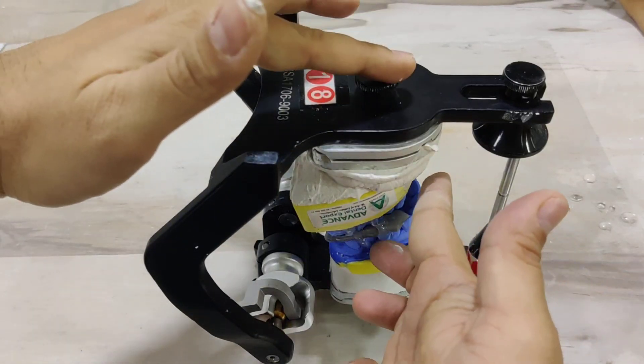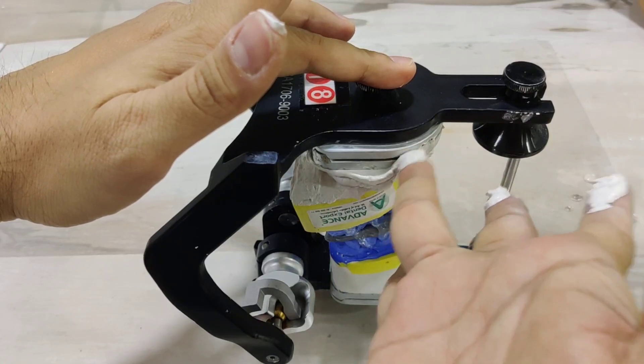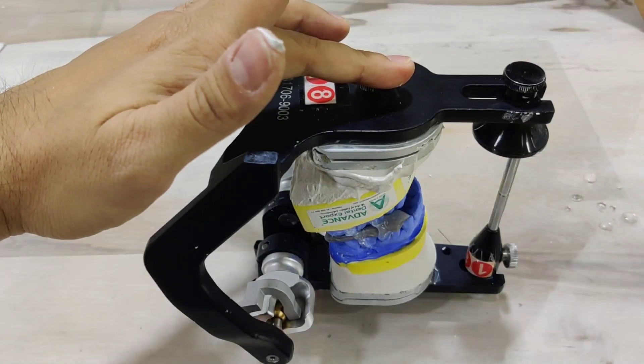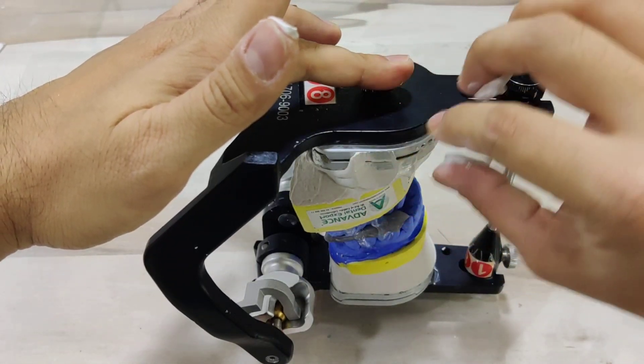You now go ahead and remove the excess cement, and in doing so, manipulate it. Remember, when I talk about a tiny instrument, sometimes the finger can be your best friend during mounting.